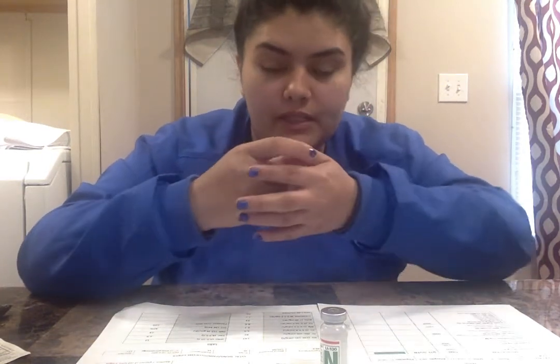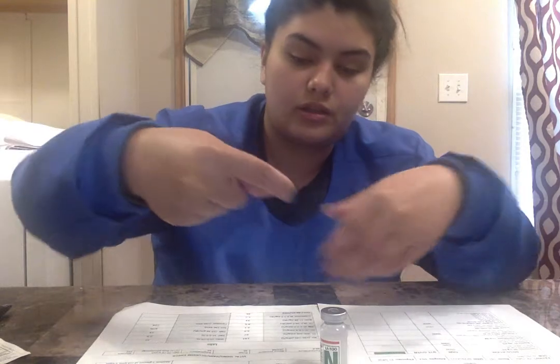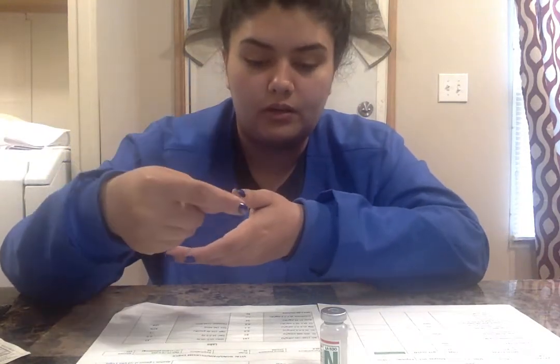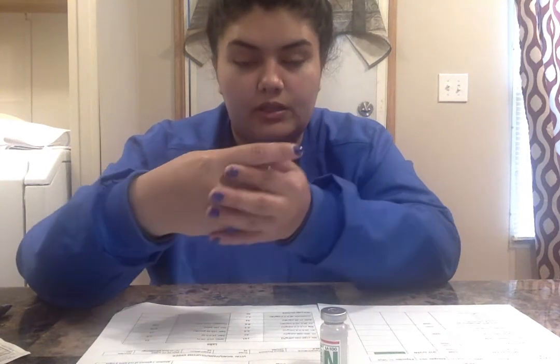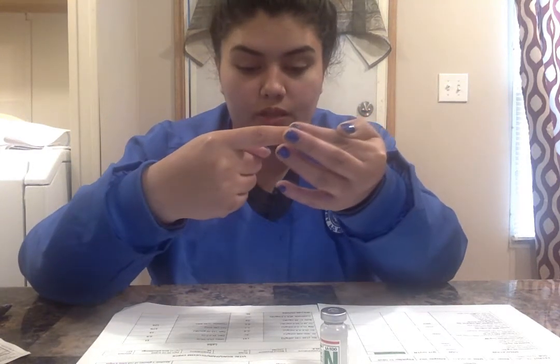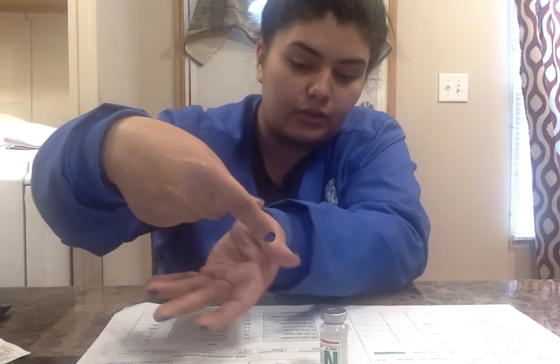You are going to grab your needle. It says that she's getting insulin and NPH, so that's just going to be my example. I'm going to draw up 25 units of air. I'm going to inject it into my NPH, and then I'm going to take it out and come over here to the clear. I'm going to draw up however many units of the clear I need, and I'm going to inject the air into the vial. Then I'm going to invert the vial, and I'm going to draw up my medication.